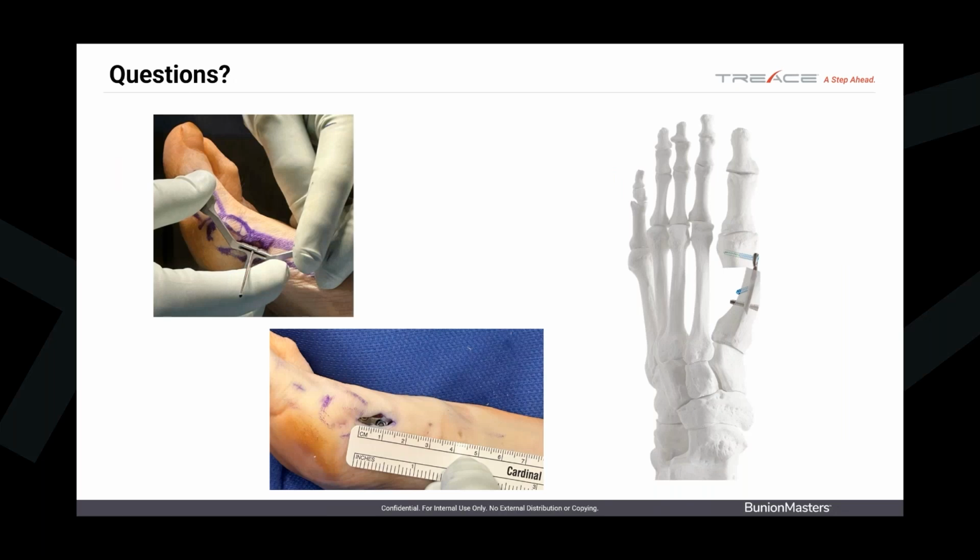Well, what about possible utilization of a tourniquet? Is that part of your setup protocol? So I do not use a tourniquet at all. I like to be able to bathe my burr, my saw in the natural cooling mechanism of the body. I also found that not using a tourniquet lowers the post-op pain. These are small little pokes. You get small little compartment syndromes at each incision site that can be somewhat painful.